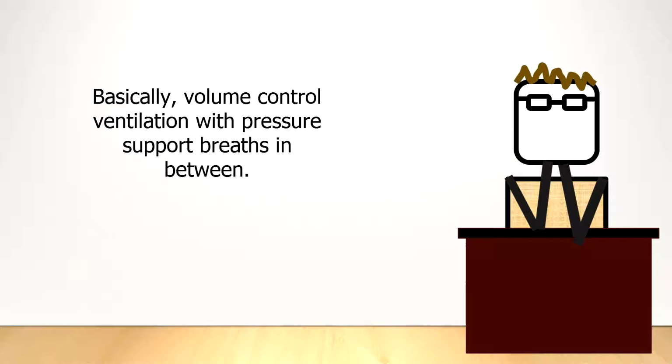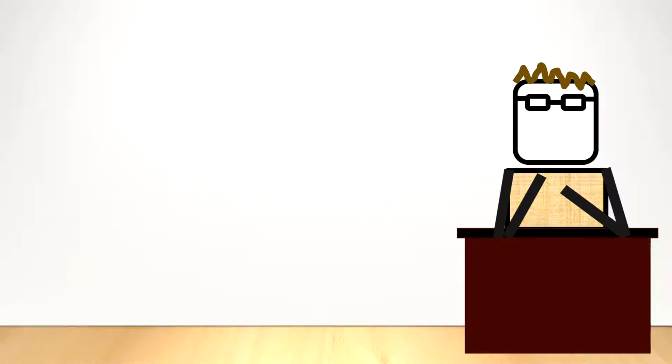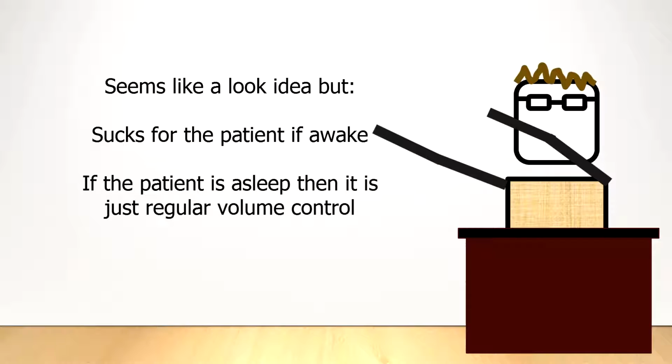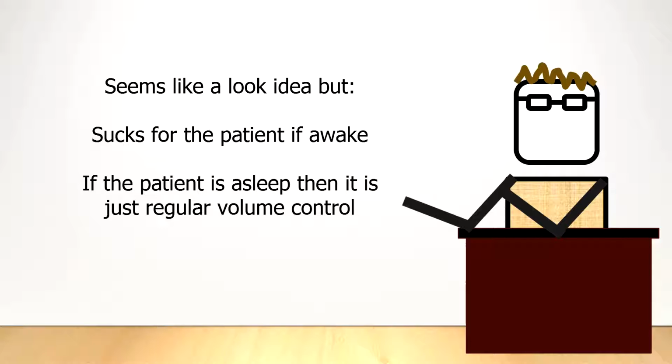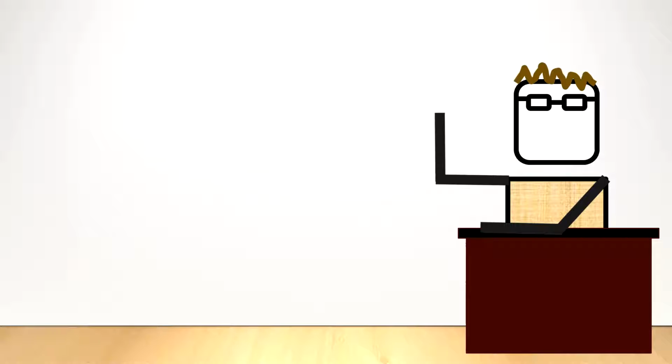Essentially, a regular volume control ventilation mode is set, and between these controlled breaths, the patient can take their own spontaneous breaths. Usually, the ventilator will also provide some pressure support breath for each of these spontaneous breaths. This mode is becoming increasingly unpopular and is largely falling into disuse.